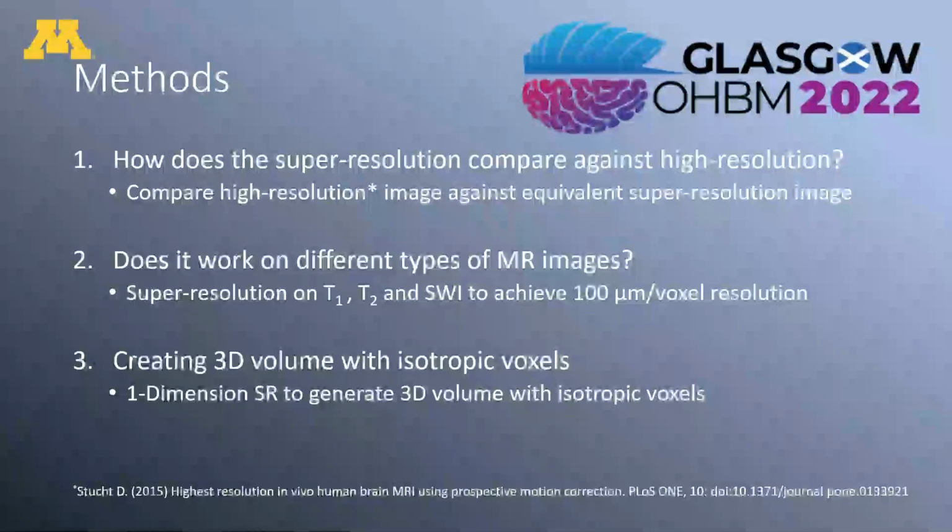So I wanted to test 3 different questions that I had. The first one: how is it going to actually compare against the high resolution? So I acquired a high resolution image, and then I acquired 4 different frames and tried to compare the two images.